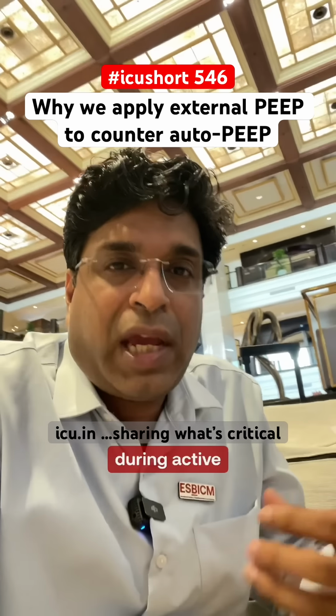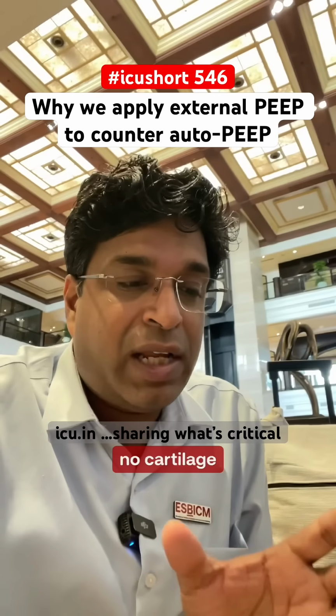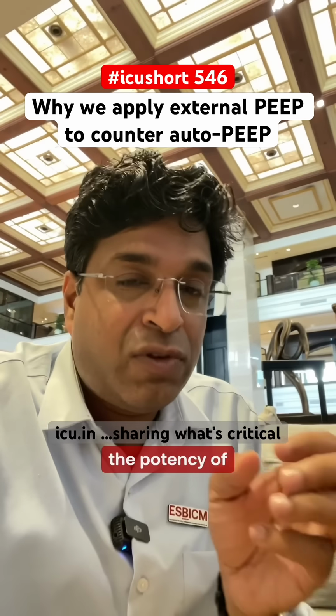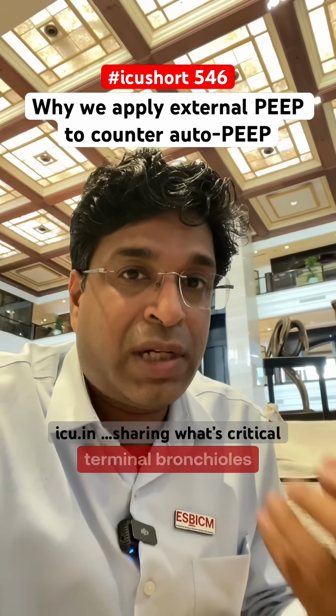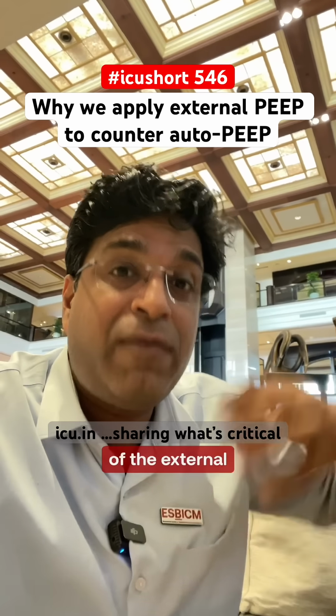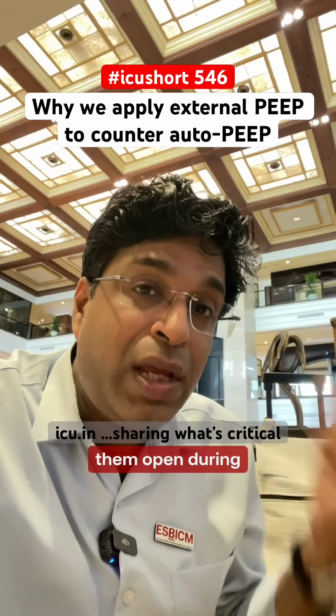So what happens during active exhalation? Because of the surrounding force, and there is no cartilage, they get collapsed. So to maintain the patency of those collapsed airways, those terminal bronchioles and bronchioles, you need an application of the external PEEP, of which we apply 80% to keep them open during exhalation.